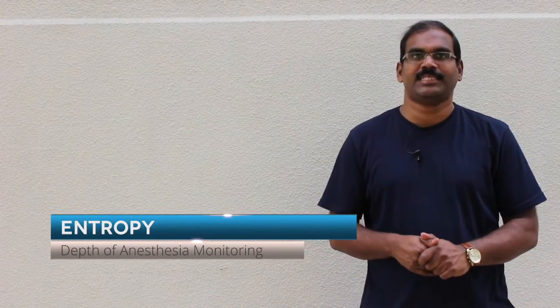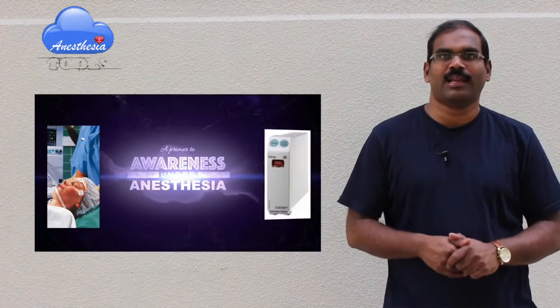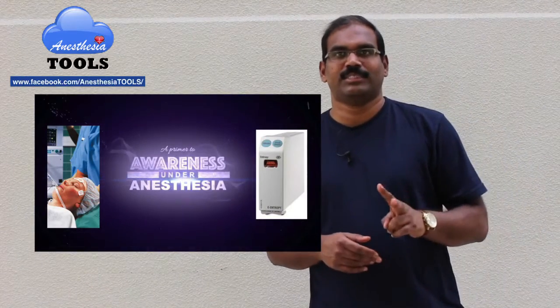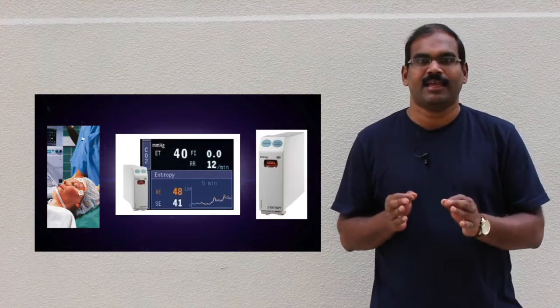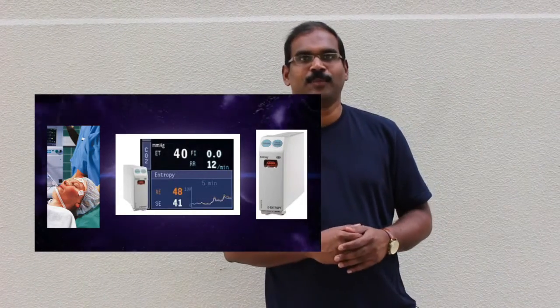The E-entropy monitor measures irregularity in spontaneous brain and facial muscular activity. It uses a proprietary algorithm to process EEG and frontal electromyography data to produce two values that indicate the suppression of brain electrical activity or depth of anesthesia: response entropy (RE) and state entropy (SE). The response entropy scale ranges from 0 for no brain activity to 100 for fully awake, and the state entropy scale ranges from 0 when there is no brain activity to 91 when fully awake. The target range for entropy values is 40 to 60. Response entropy and state entropy values near 40 indicate a low probability of awareness with recall.